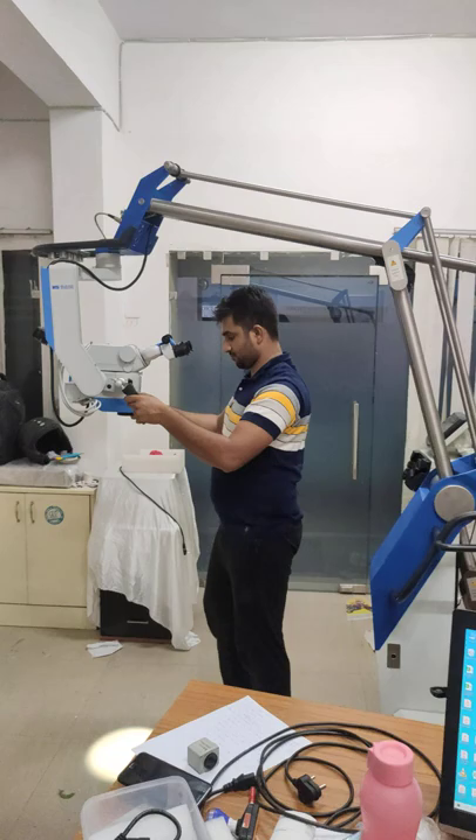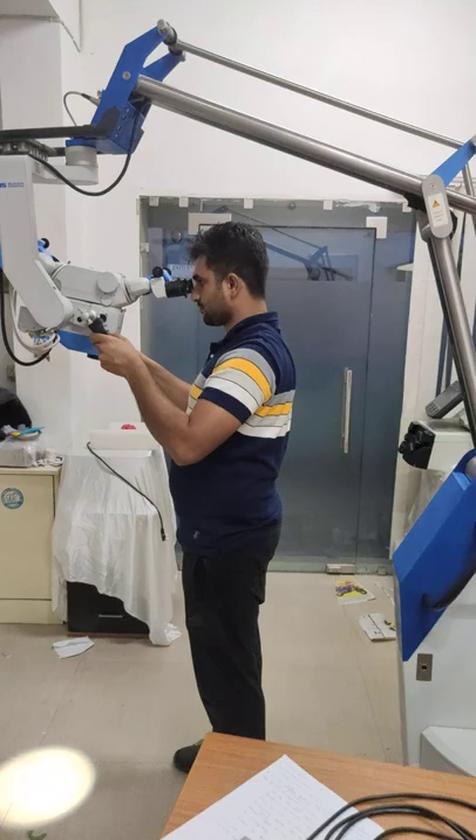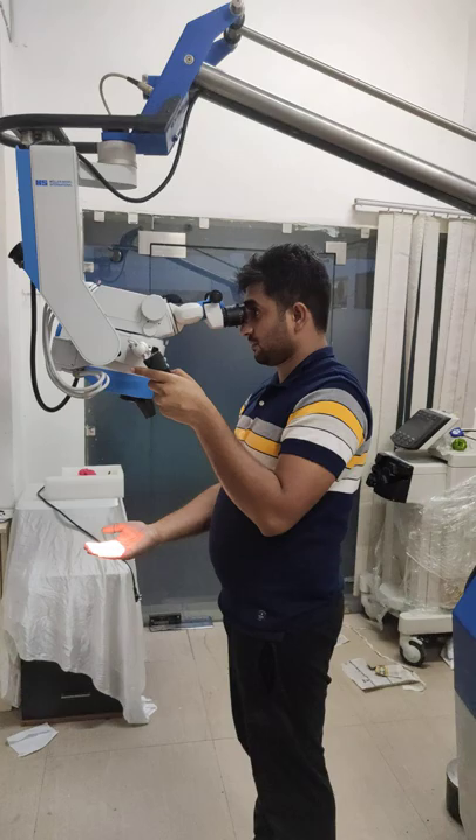Now you can see the overhead position clearly. You can easily perform surgery by standing like this.